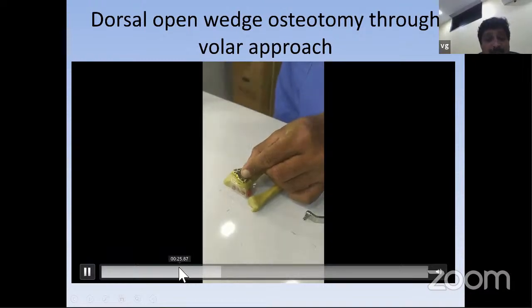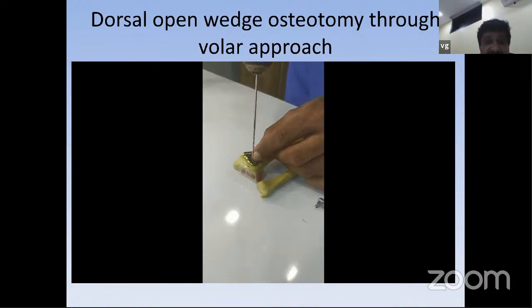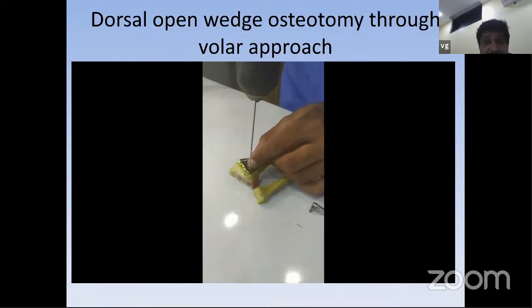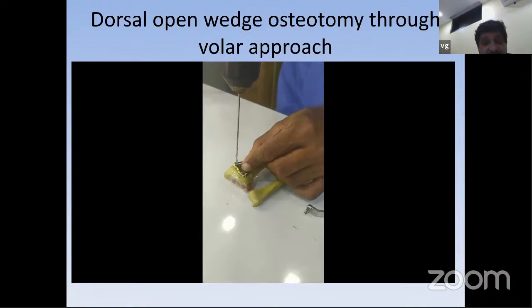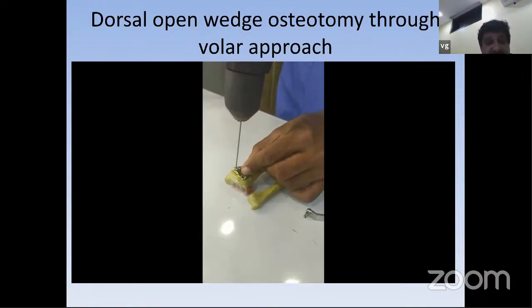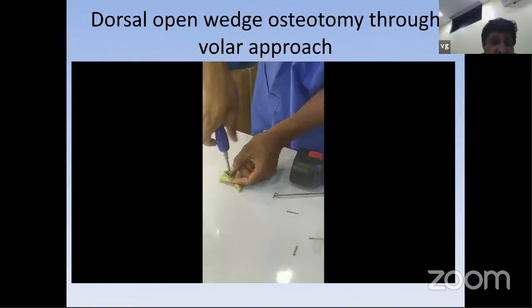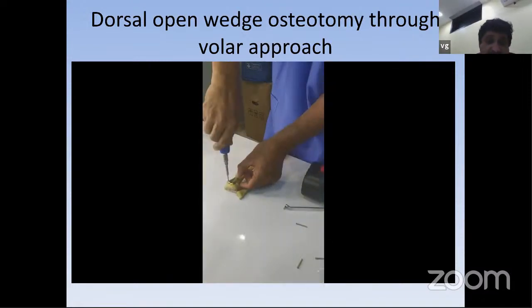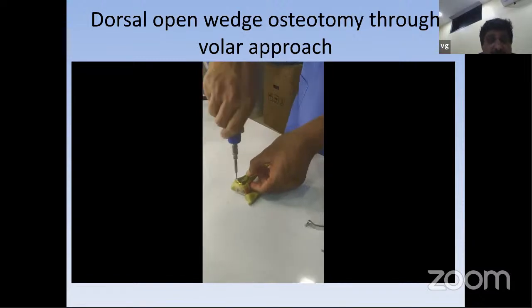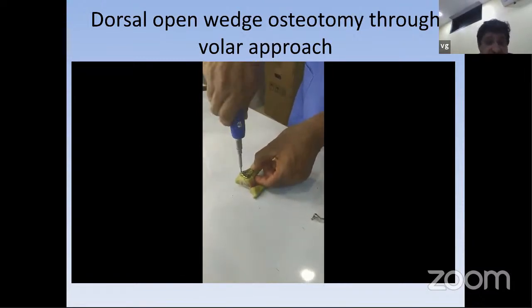So what we did is the osteotomy. We fixed it distally into the distal fragment. This is done freehand because we don't want to use a sleeve. We just don't want to go into the joint, so stay away from the joint. So you tighten at least 2 locking screws. If it is an osteoporotic bone, you can use 3 or 4 locking screws into the distal fragment.